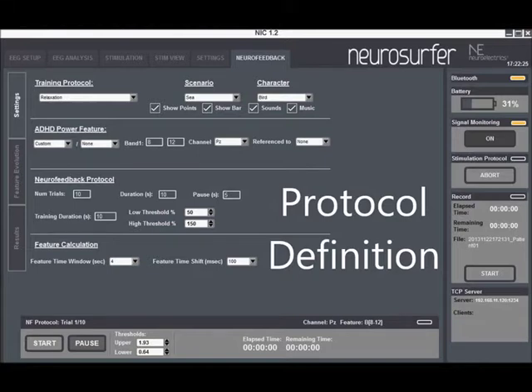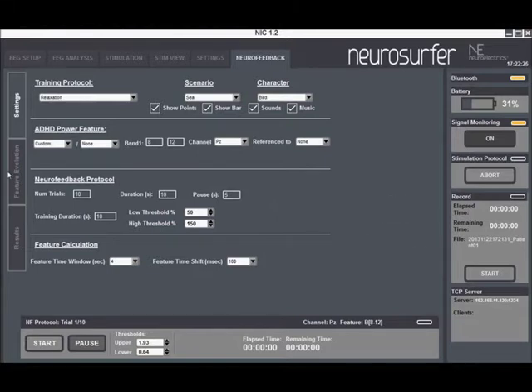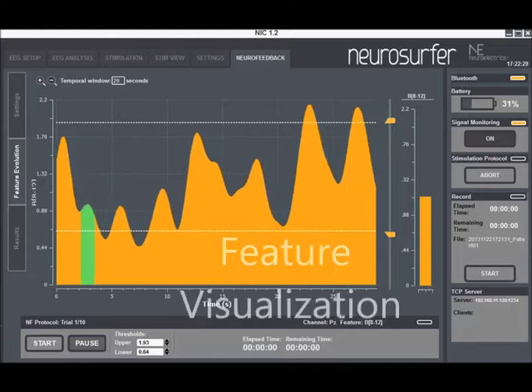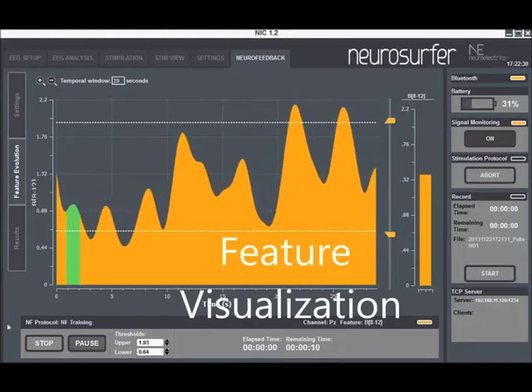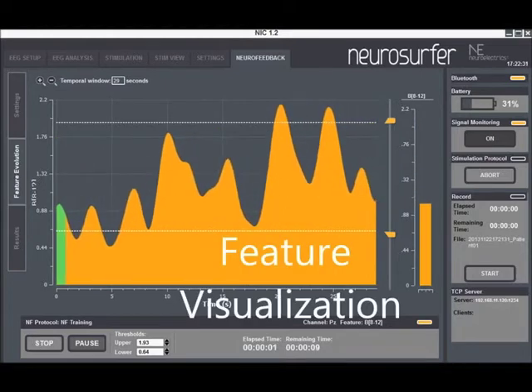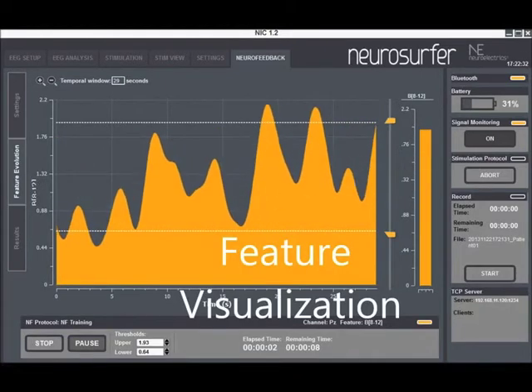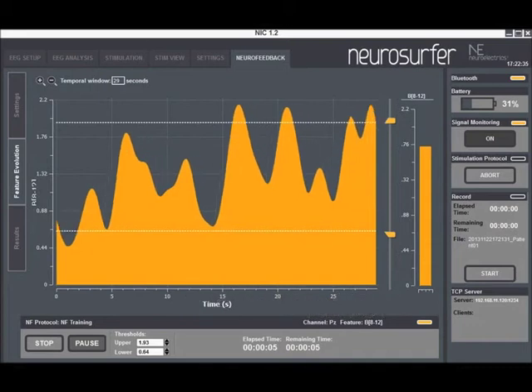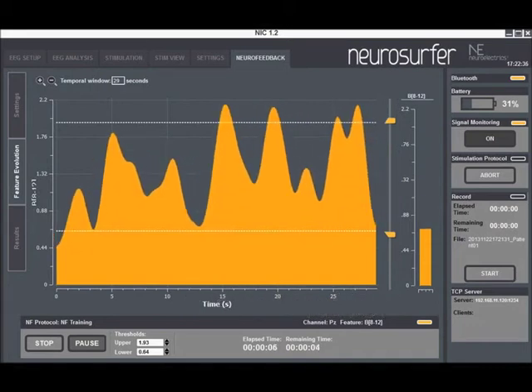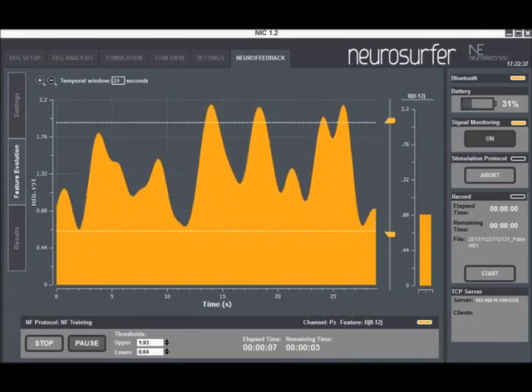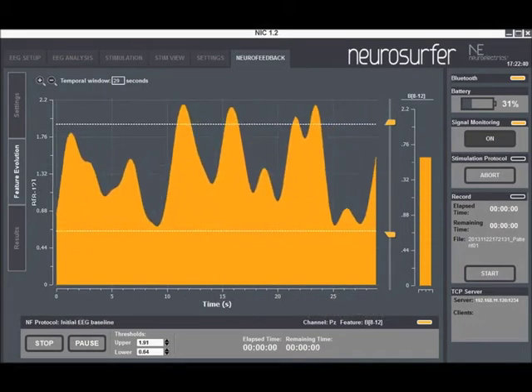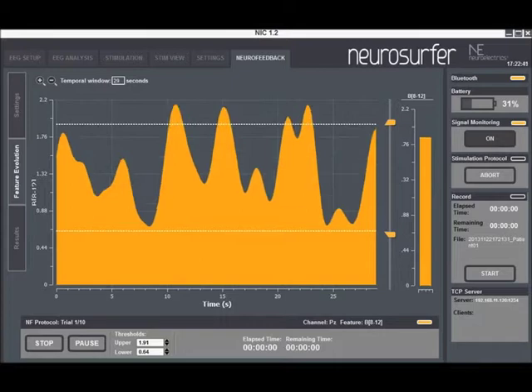Different game scenarios can be chosen. Once a feature for feedback is selected, it can be monitored online. Upper and lower thresholds can be set to define the game target zone, and they can be manipulated during the training session as well.